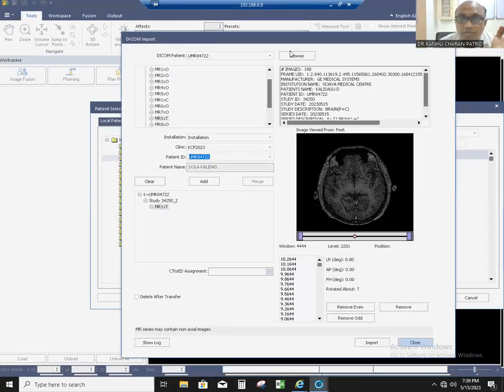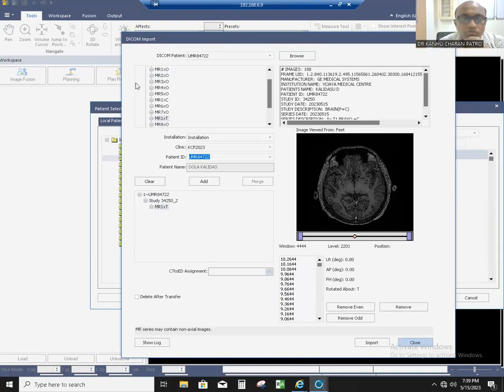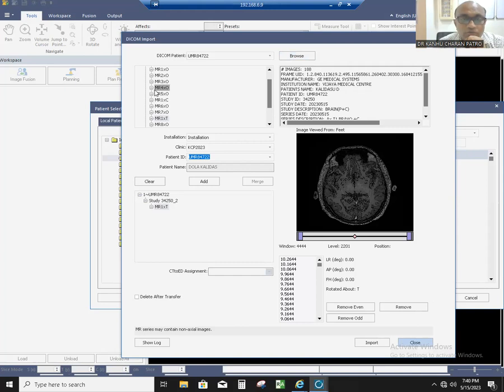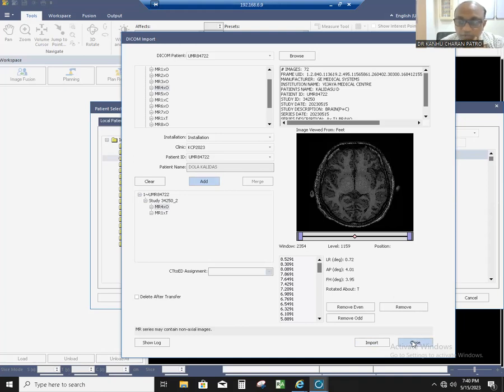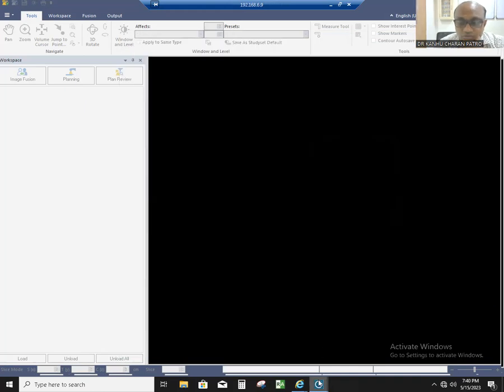I am doing the planning in the Electa system, and I am very much acquainted with the Monaco system. You can go through these things — you put your record number, you will get the various MR images. Or if you want to import from CD or pen drive, you can click Browse. You will get an icon called Abort/Accept — always you have to accept. You click Add and then Import, and it will get imported into your system. After loading from the CD or DICOM system, you will be importing the important sequences.